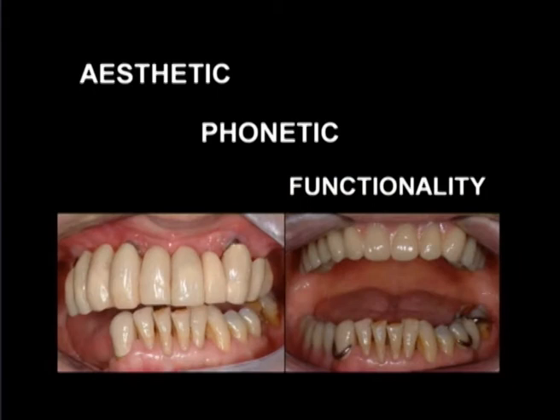Denture margins are usually sealed to the gingival ridges in a very good way, allowing excellent phonetics and avoiding saliva or air dispersion. Patients can be assured that no inconveniences will disturb their social life.